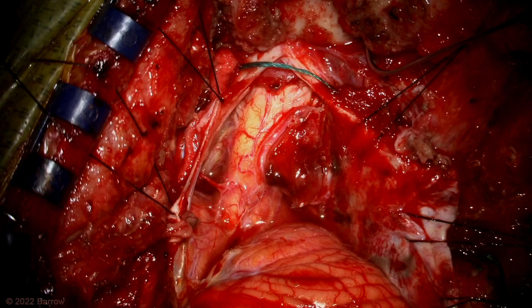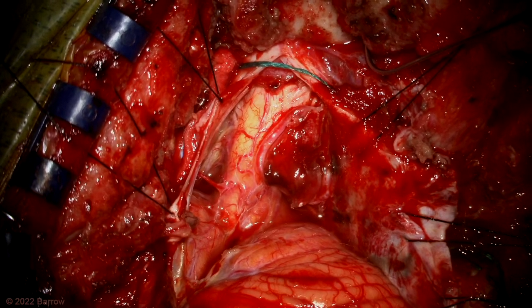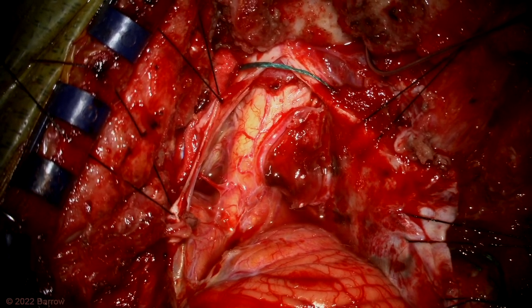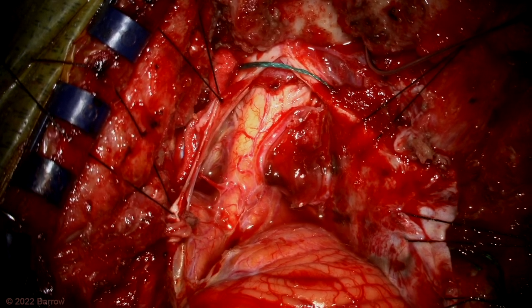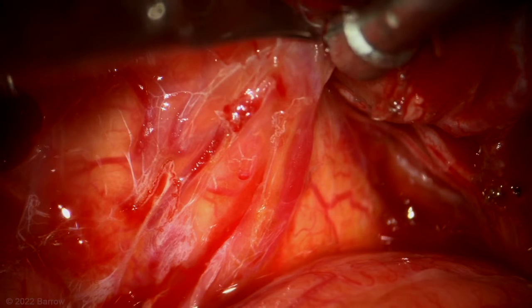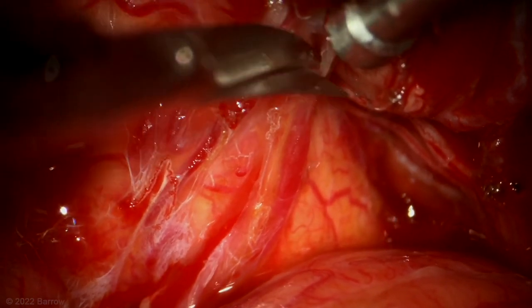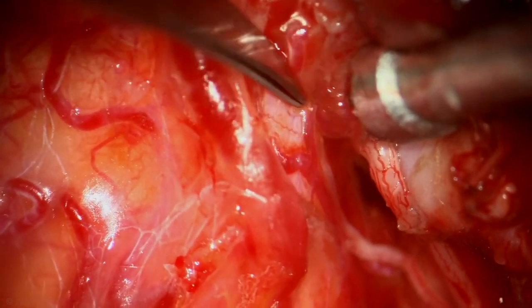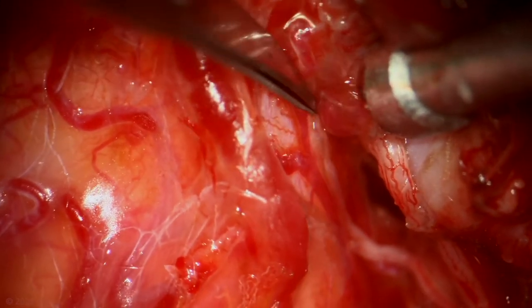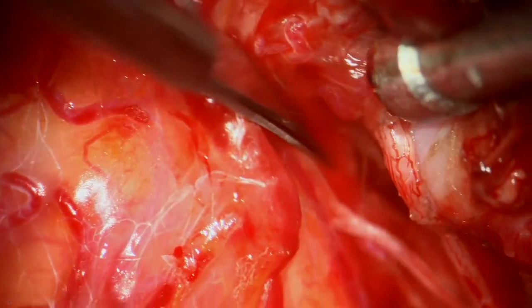Here is an overview of the surgical exposure with the far lateral approach. The aneurysm is seen in the center of your screen, covered in thrombus. The top of the head is at the bottom of your screen and the feet are at the top. The initial dissection began on the distal PICA segment coming from the aneurysm itself, which was then traced proximally. The aneurysm itself was densely adherent to the lateral medulla.